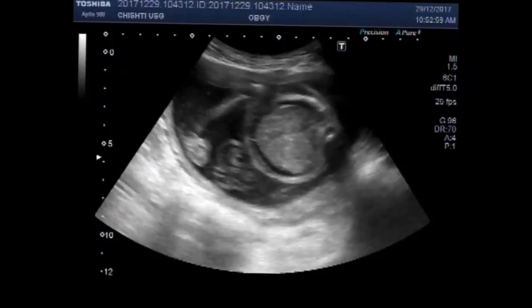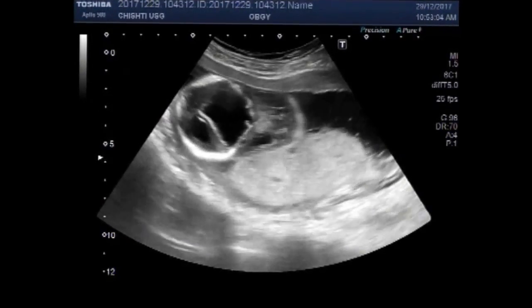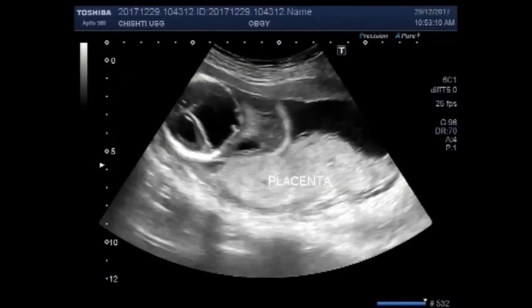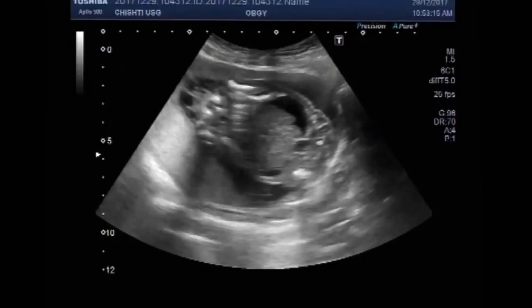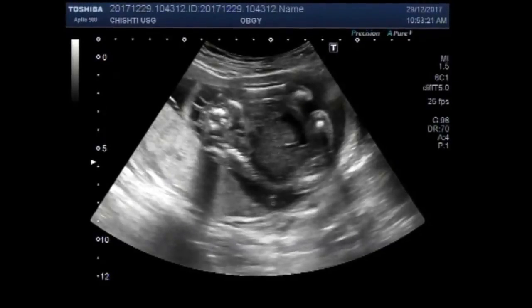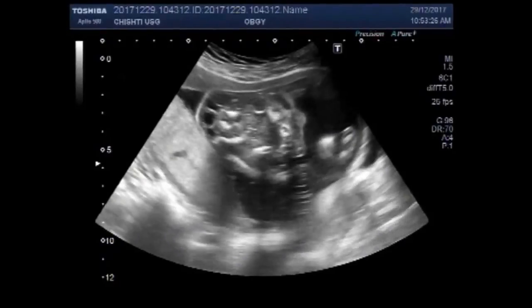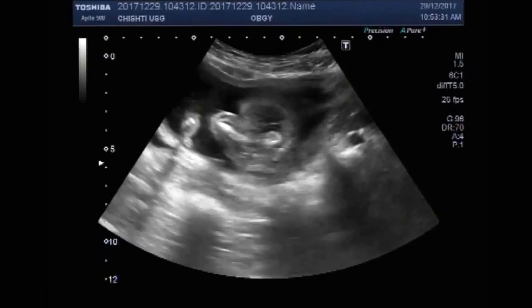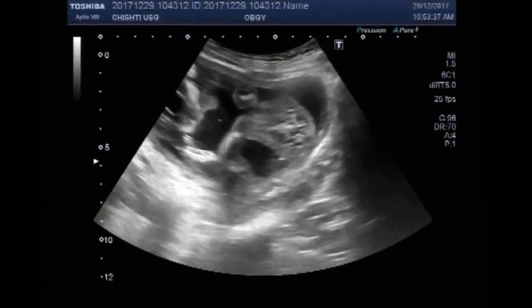Now you can again see the fetal abdomen, fetal head and encephalocele, and the placenta posteriorly attached. This is the lung of the fetus.